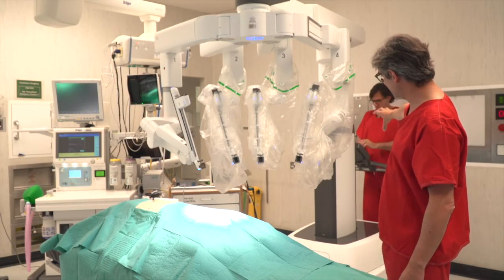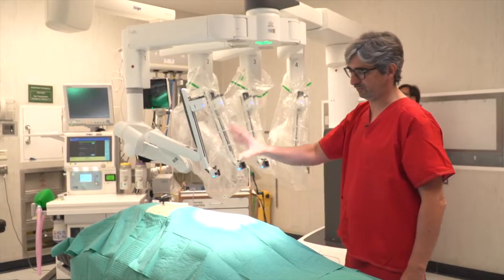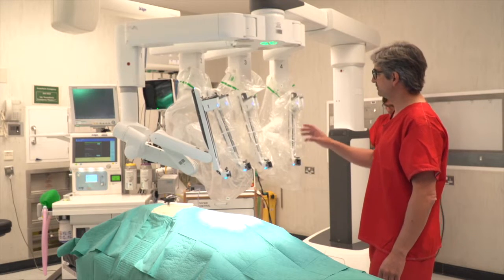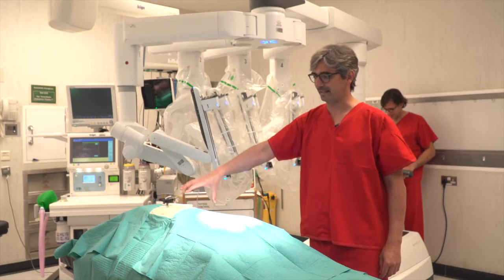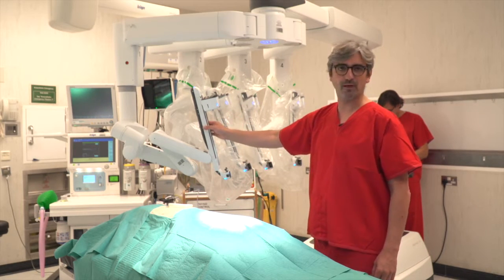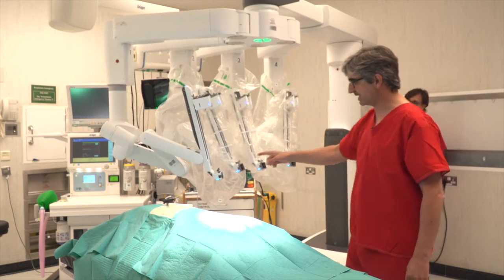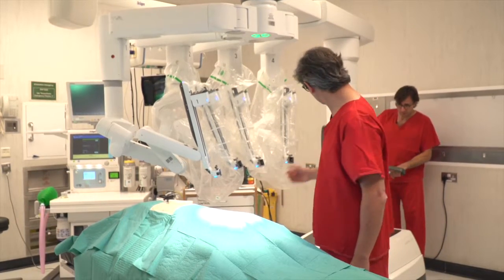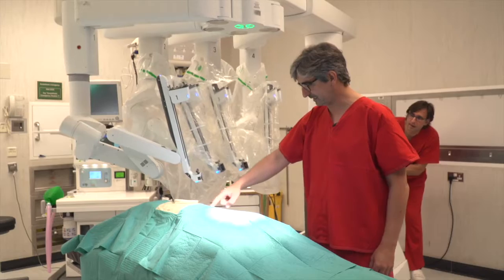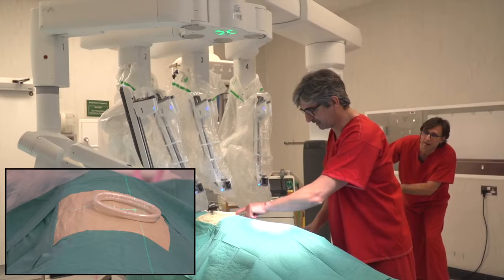It doesn't matter if the robot is on the left or on the right. For this right side case — this is right upper — we are on the right thorax, we need to cancel arm one. It is very important now to move the robot with the laser. There is a laser here. Just the cross should be in the upper part. You see the cross here, the laser.